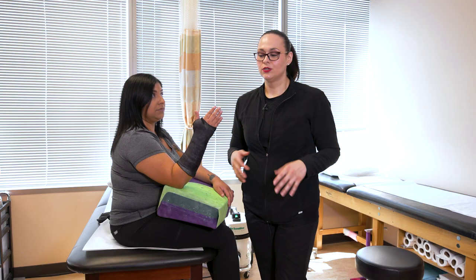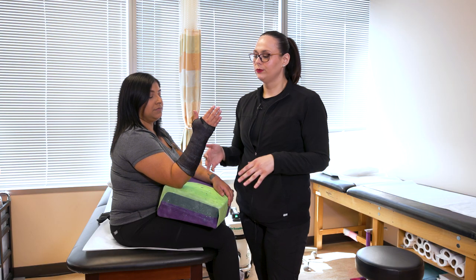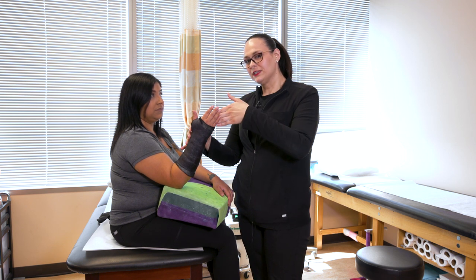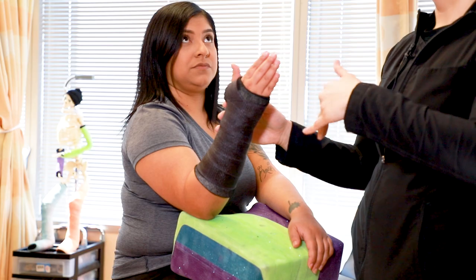If your cast does get wet on the inside, give us a call and let us know so we can change it out for you. In the meantime, you can use a blow dryer on the cold setting to try to dry it out as much as you can until you get to us.